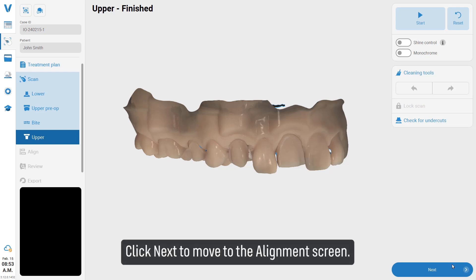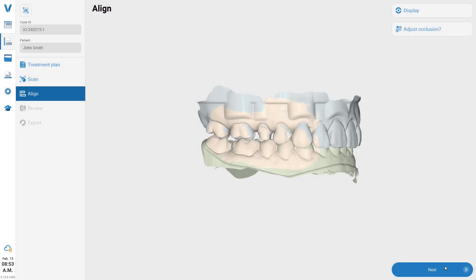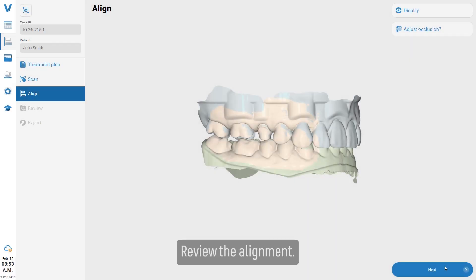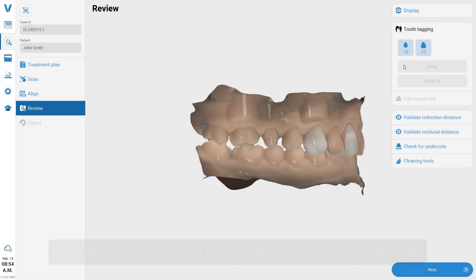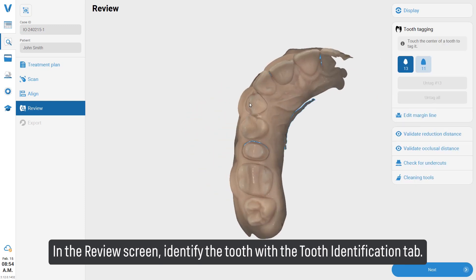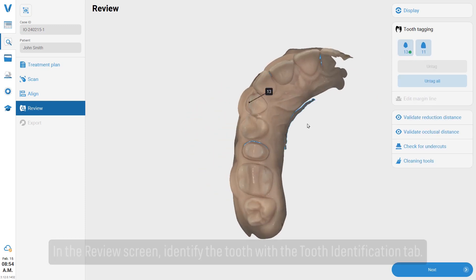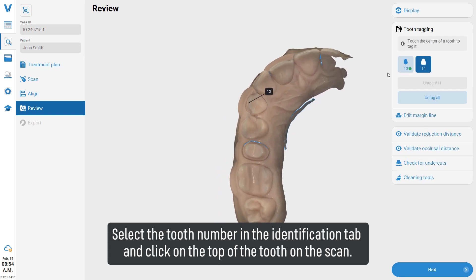Click next to move to the alignment screen and review the alignment. In the review screen, identify the tooth using the tooth identification tab and select the tooth number in the identification tab.